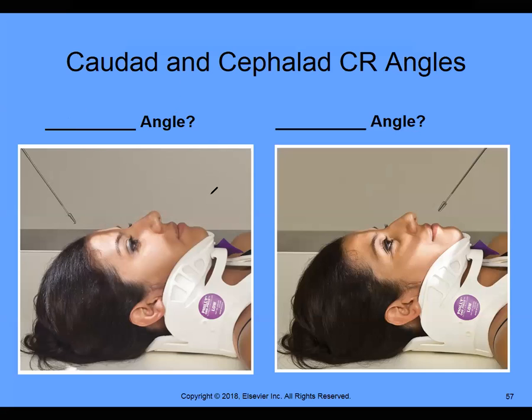All right, so whenever we have to angle our X-ray tube for axial projections, we need to know or follow instructions. Which direction am I going to angle? Remember I told you that your Bontrager books are very similar to what you would follow on a recipe, right? We need to be given instructions for everything that we're doing, and we need to follow them.